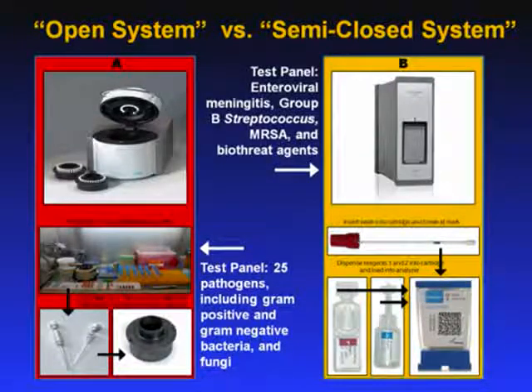These manual methods may expose samples to contamination from ubiquitous organisms in the environment. Manual processing may also be vulnerable to user error. More recent tests, such as the Cepheid GeneXpert, utilize self-contained reagent and reaction packages which reduce the potential for contamination. The GeneXpert system is currently the only near-patient PCR-based pathogen detection system with a semi-automated cartridge-based design.